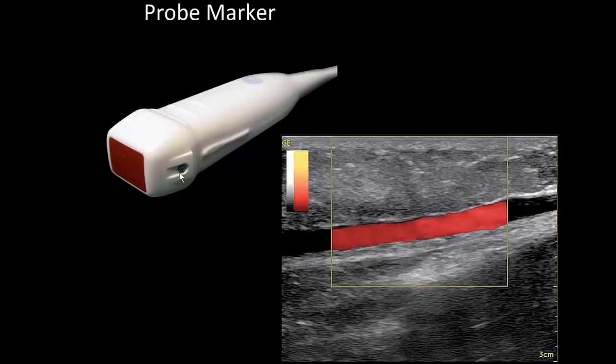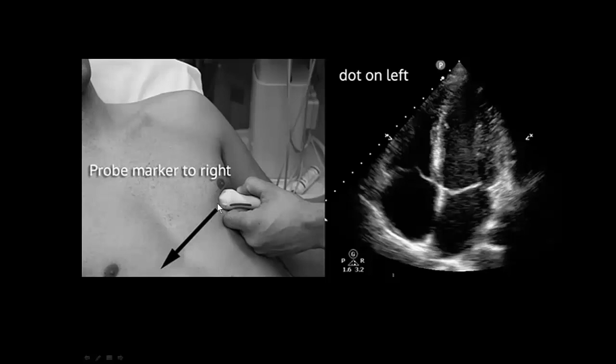When you look at your ultrasound probe, you will notice it has a little marker — either a ridge, a little knob, or on modern devices, even a little LED. It's very important to track what direction this is pointing in. Most of the time we will have the probe marker pointed toward the patient's right or cephalad. This will be reflected in a marker on the screen. If this marker was reversed, we would have a 180-degree reversed image on the screen. So if at any time during your scans you are confused because you are seeing a mirror image, check that probe marker.